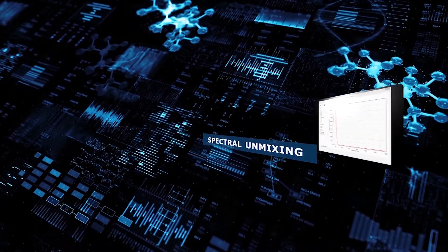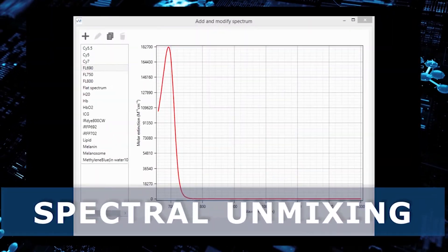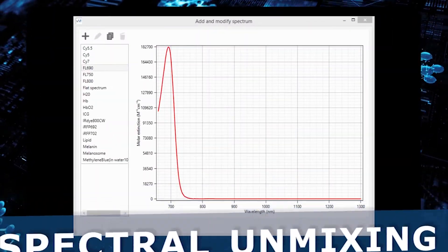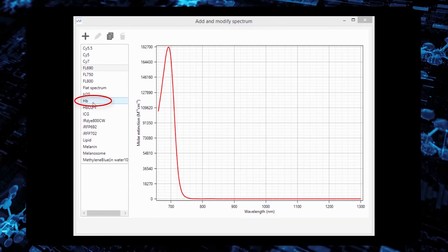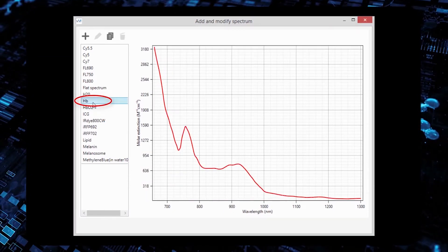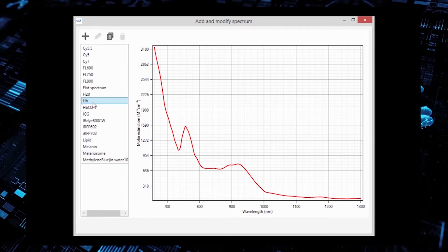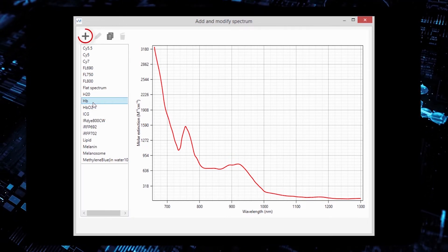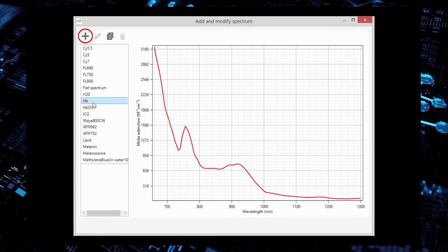The next step is spectral unmixing. It allows the user to select from a range of chromophores or to add a new spectrum of interest.